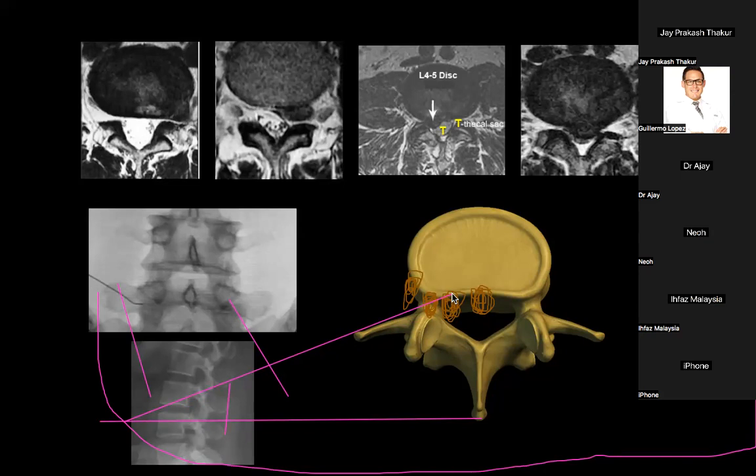So over the skin, you check the lateral view. You're seeing it from here, right? This is the patient's abdominal part. Now you put a marker over the skin of the patient and put a point that this is my far lateral approach. I can go this much away from the midline. Now you can clearly make out this distance. Can you make out this distance?